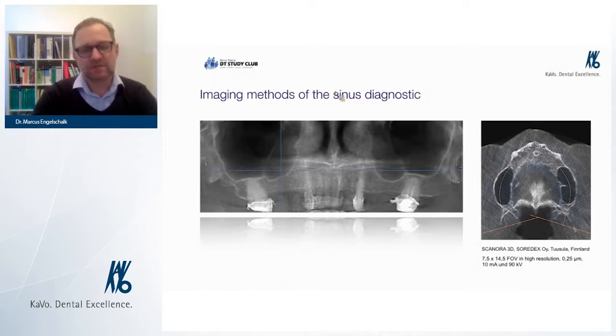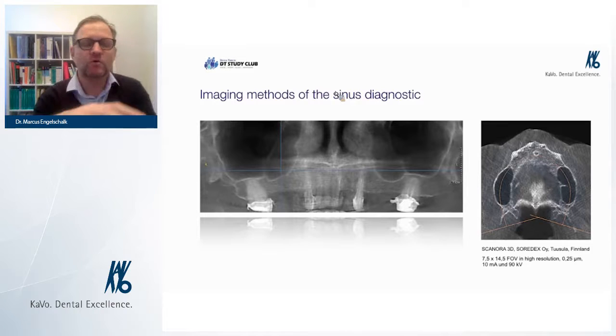So if we treat this mucosa, we have to be very careful, because 1 millimeter is very thin. We'll see if it's better to have a thicker membrane or not. A thicker membrane will be created by some chronic diseases of the sinus. This is very important to know.